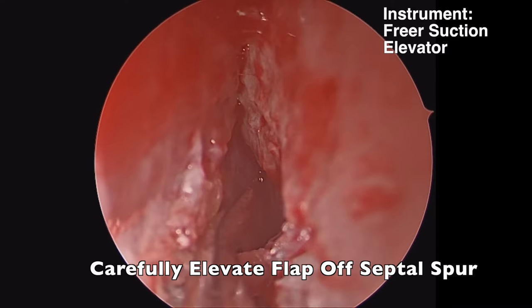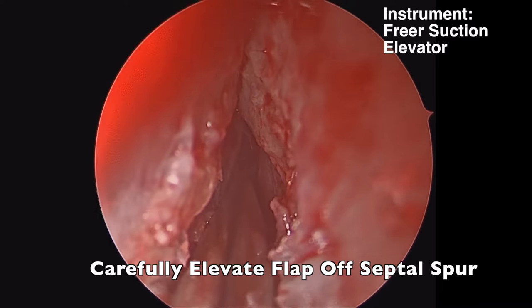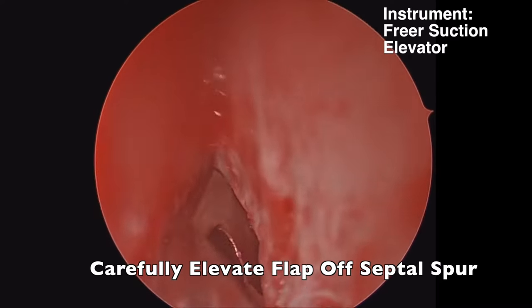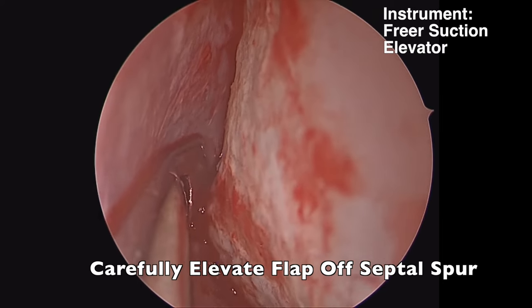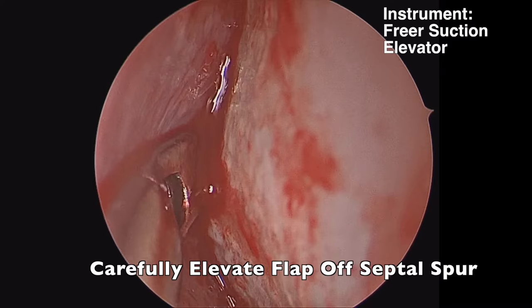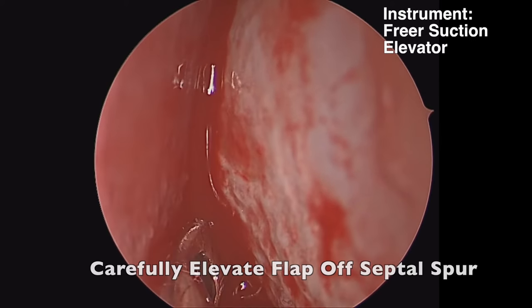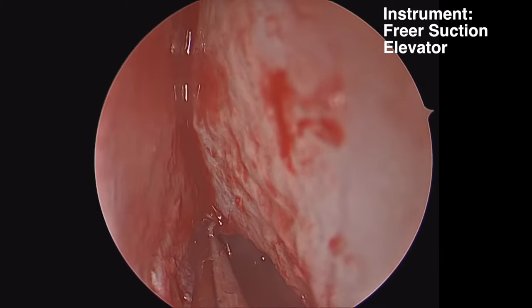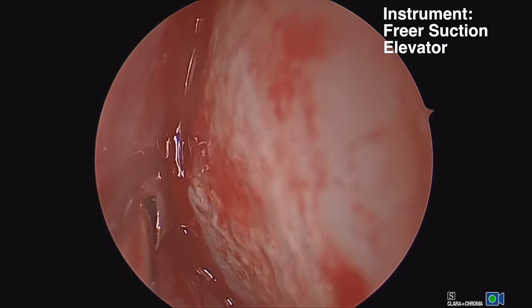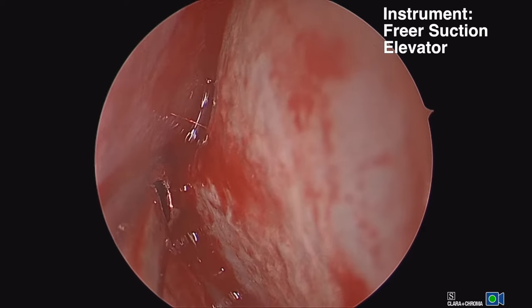We've reached the portion of the septum where we have a spur. I usually make the incision on the side of the septum where there is a spur or a more convex septal deviation. If we make the elevation above and below our spur, we can make a tunnel in our elevation and then come over the spur, and we're less likely to tear it.